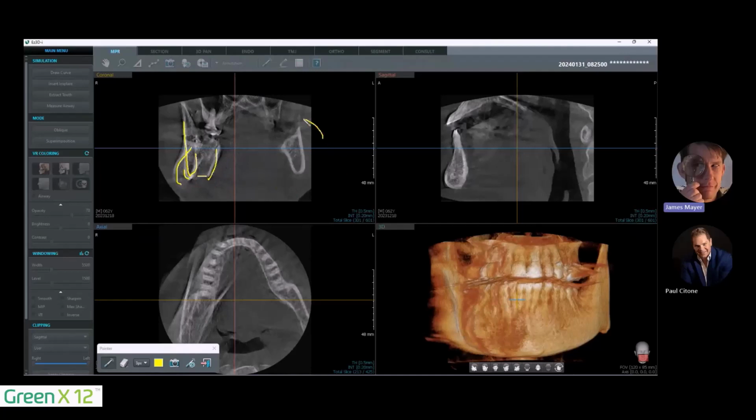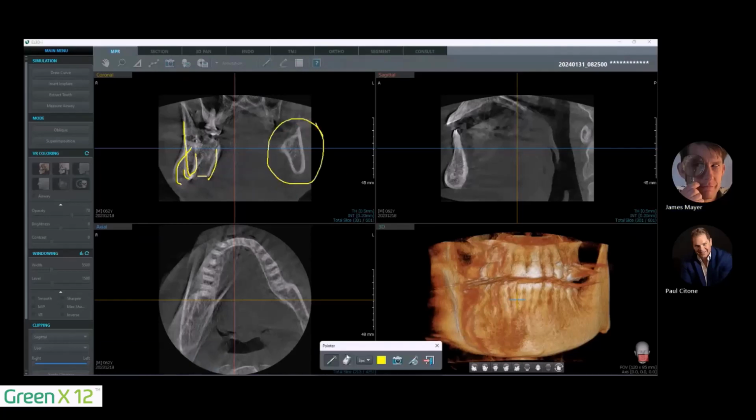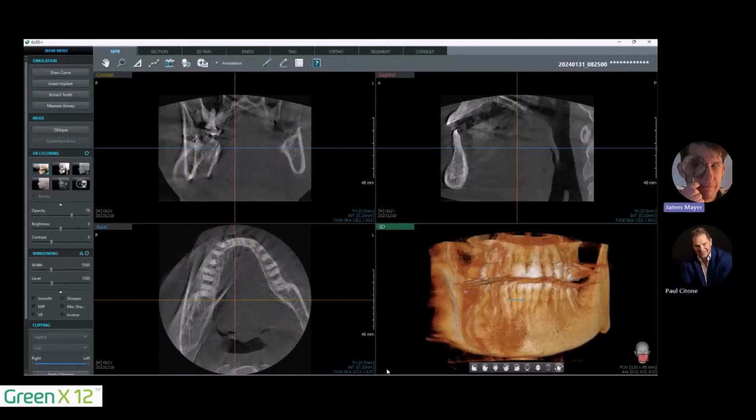Whereas we look on the patient's left side, look how clear it is here, which is also translated in the mandible, patient's right side versus the left side right here. Yep. So that's a very good example of looking and recognizing patient movement within a scan. I'm going to go ahead and jump back to EasyDent Eye software here. Did you want to add something here?